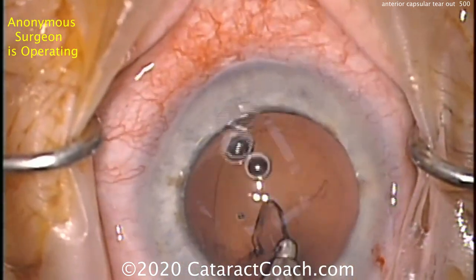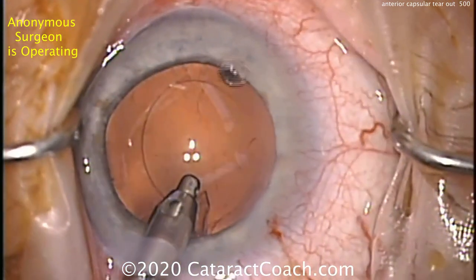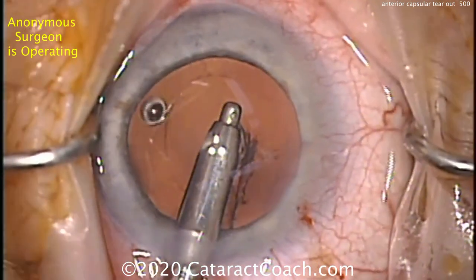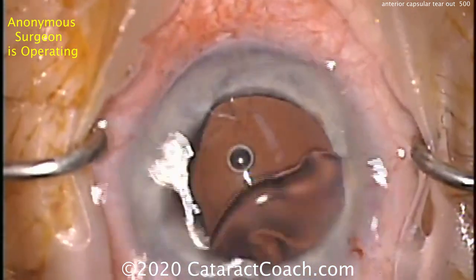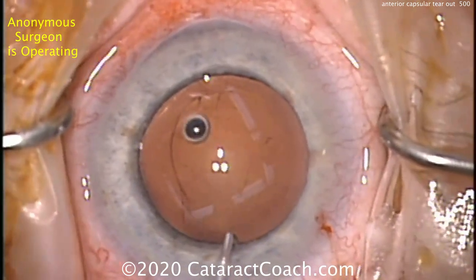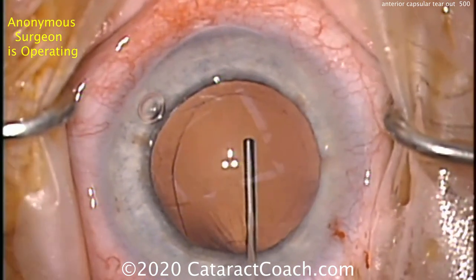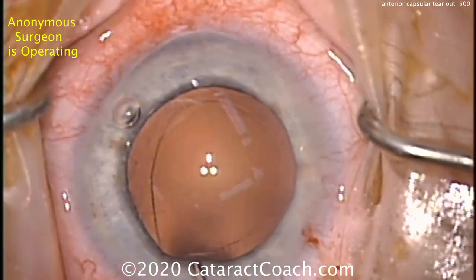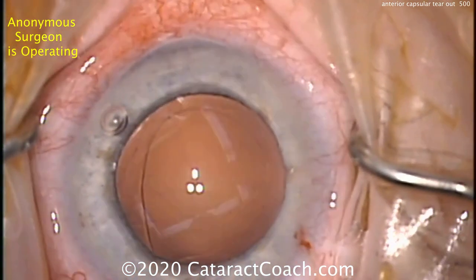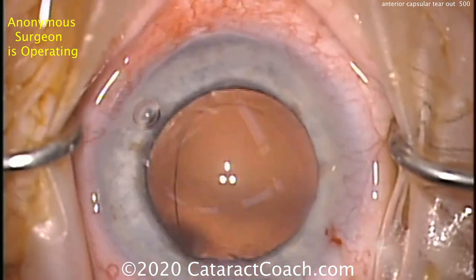There it is — in that sub-incisional space we can see the radialized capsule rhexis edge. At this point you've got to be very careful. If you've noticed it by now, fill the eye with viscoelastic through the side port and don't let it deflate. Take your time. Gently inflate the capsule bag — you don't want a massive inflation to cause any pressure. You don't want that radialized area to zip around the lens equator and tear the posterior capsule. It can definitely happen, it can definitely run back there.